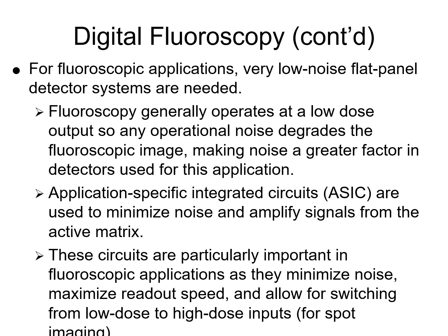Okay? And so application-specific integrated circuits, that is, the way that you engineer the circuits in the pixel matrix, can help correct the noise generated by the pixel matrix. Those are included in all flat panel detectors, but the application-specific integrated circuits, the extra components that we add to eliminate noise, are more important for digital fluoroscopy because they make the image receptor more efficient, and they actually boost signal to noise ratio and improve the efficiency of the image receiving components.